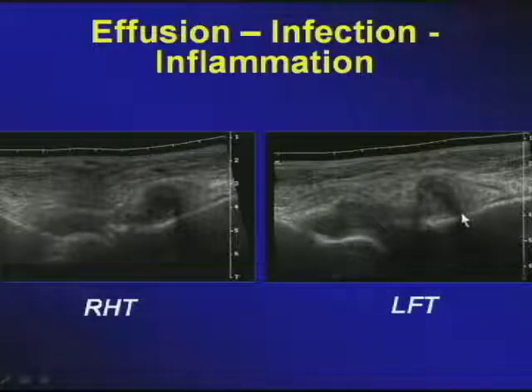Likewise, if you take a look at the left elbow, not only do you appreciate the same capsular distension, but this is a great and beautiful example of distended fluid and synovium in the annular recess, which occurs below the neck of the radius. To top it all, you'll also note that there are cortical irregularities involving not only the surface of the radial head, but also its articulating subchondral surface. So these now clue us in that this type of changes should be chronic and should be quite inflammatory.